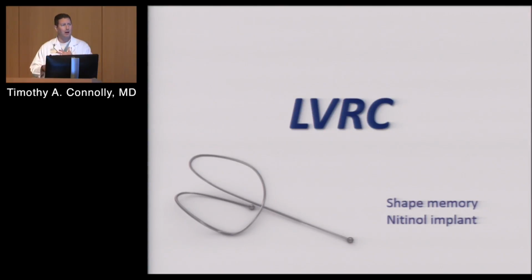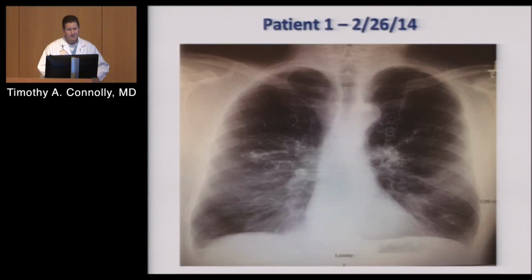We implant them in the lungs, and the purpose of it is to reduce the overall lung volume, but also to reestablish elastic recoil and structure of emphysematous lung that's been damaged. The FDA is looking into approving it. It's already standard of care in Europe. And so hopefully, in the next 12 months, we will have a green light.